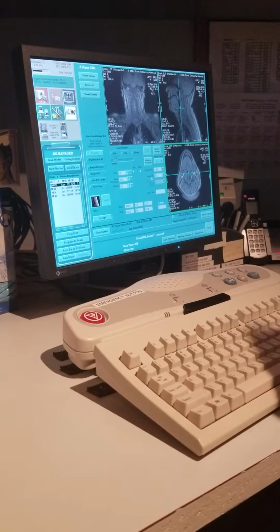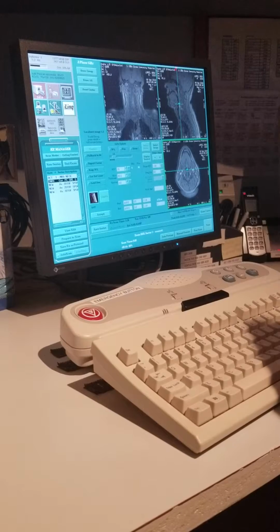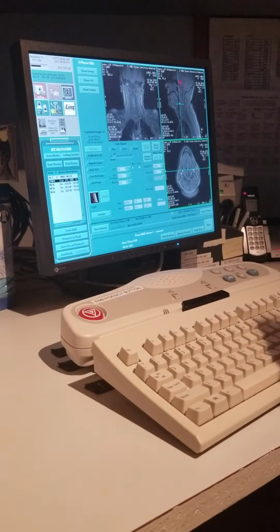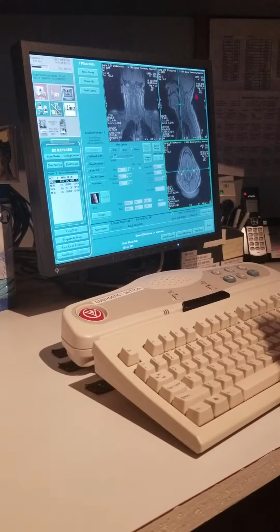This looks okay. See how this scan line right here is coronally. That's how far anterior it is on the sagittal.